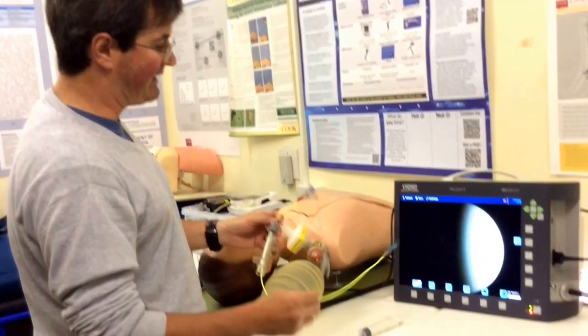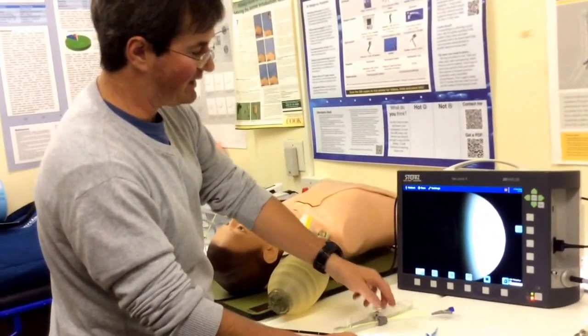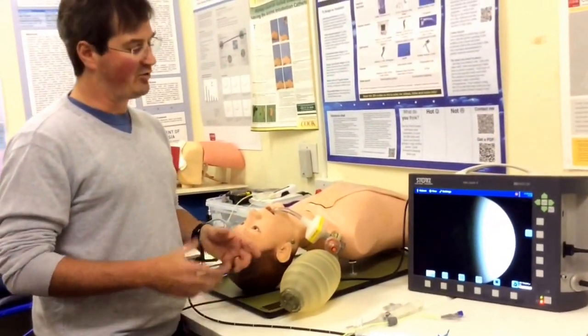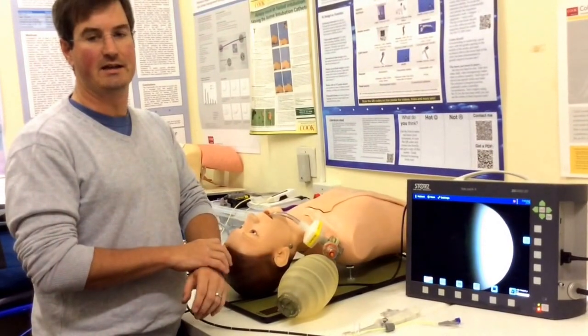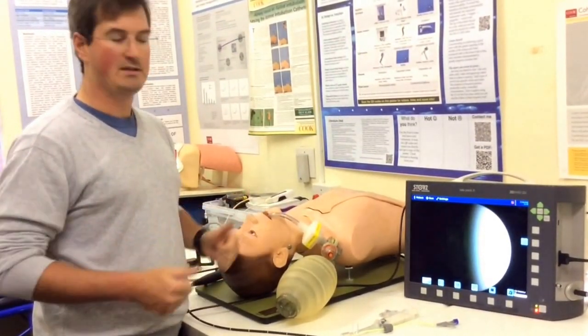So that's a very quick how-to with a bifurcated dual cuff bronchial blocker — the EZ Blocker — and they are reasonably easy to use. Another video will talk about the advantages and disadvantages of bronchial blockers versus double lumen tubes and what situations we'd use each one. Thank you.